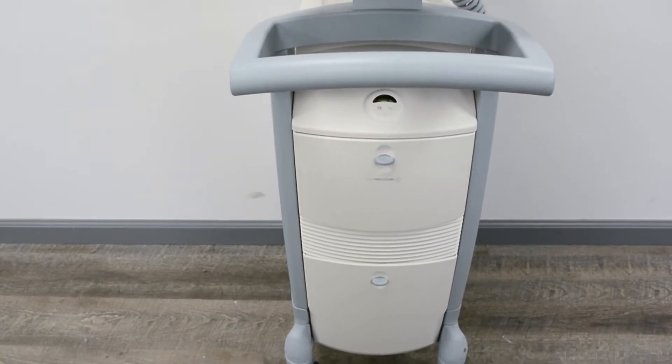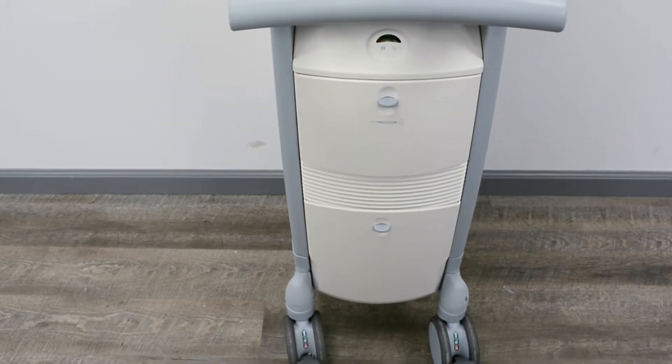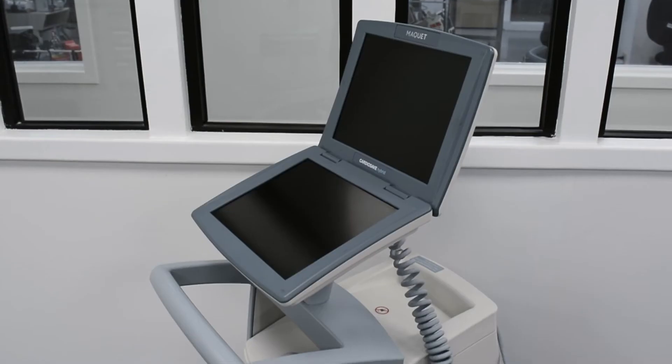The large LCD display allows the operator to view waveforms with an easy-to-use navigation and customizable controls.